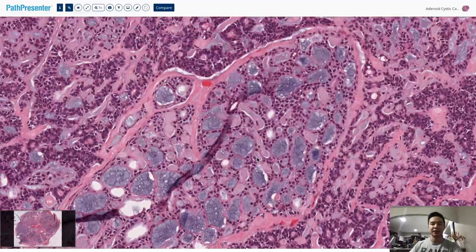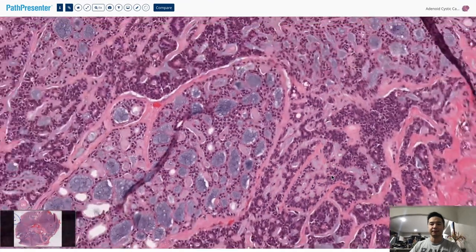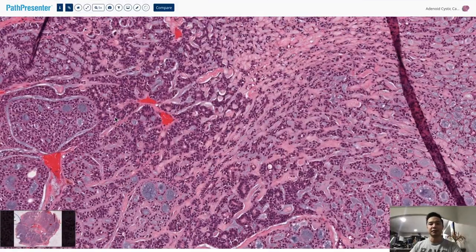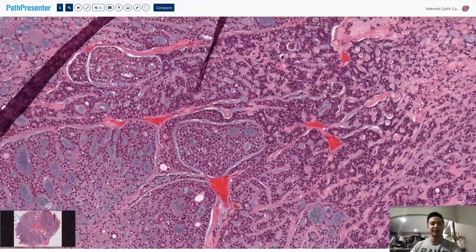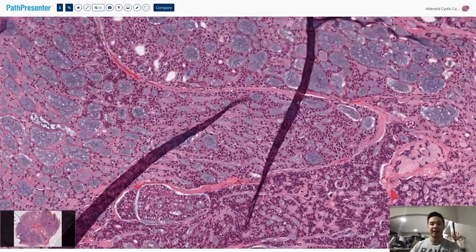In cytology, you'll see this well-arranged arrangement of cells around the myxoid stroma, whereas in pleomorphic adenoma, which is a differential, the myoepithelial cells will be embedded within the mucin. So the most common molecular translocation for adenoid cystic is translocation 6;9, MYB-NFIB.